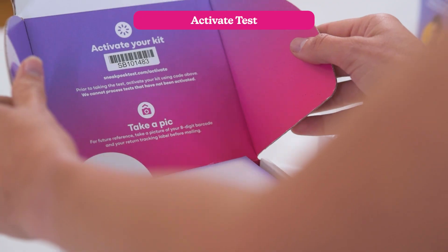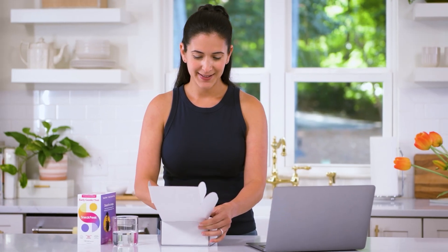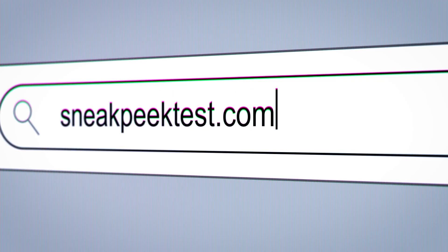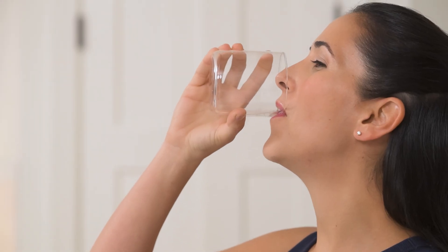First, activate your test kit. We can't process Sneak Peek samples that aren't activated. Locate the barcode on the inside top flap of your test kit, then go to sneakpeektest.com/activate and fill out the activation form. As you're doing this, drink a full 8-ounce glass of water. This will help with blood flow and make your sample collection easier.